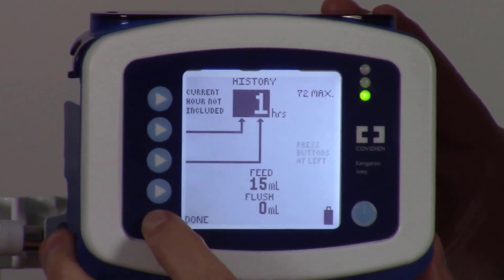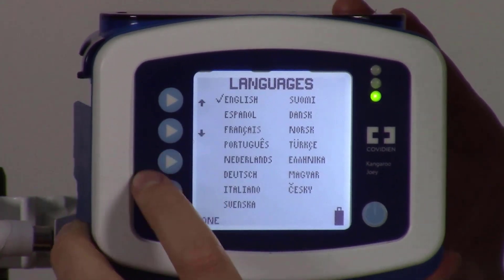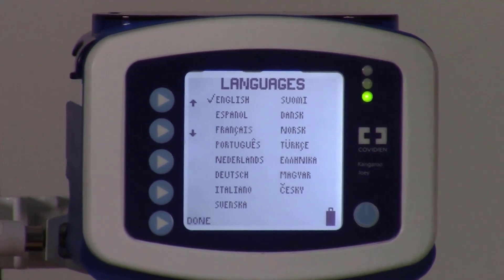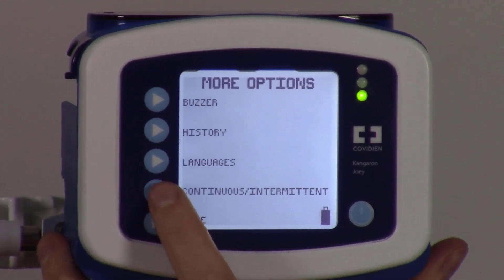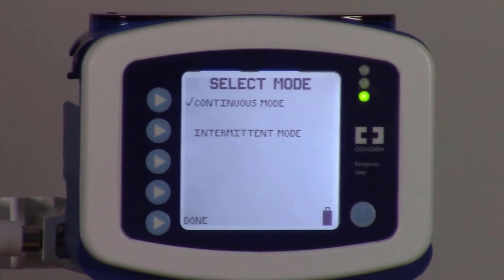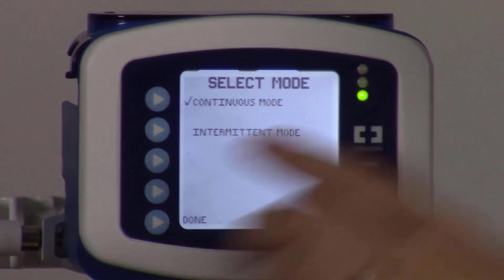Languages gives you a list of options to change the pump language; you can scroll through using the top two left buttons. We'll keep it on English for our purposes and select Done. Last is Continuous/Intermittent — we would prefer that you keep it on Continuous mode, so ensure there's a check mark by Continuous mode and select Done. Thank you so much for watching this video and learning how to use the Kangaroo Joey feeding pump with the Feed and Flush Bag.